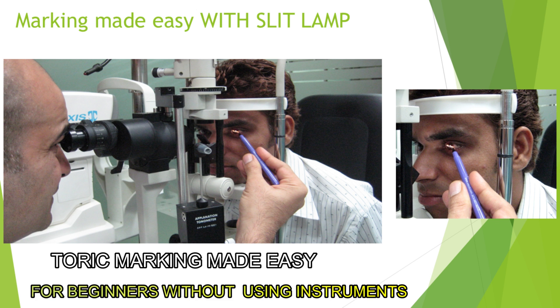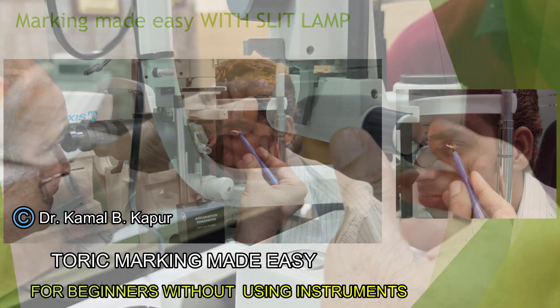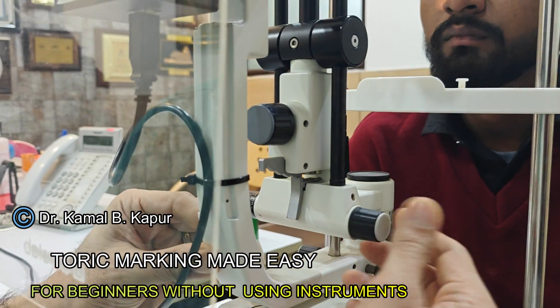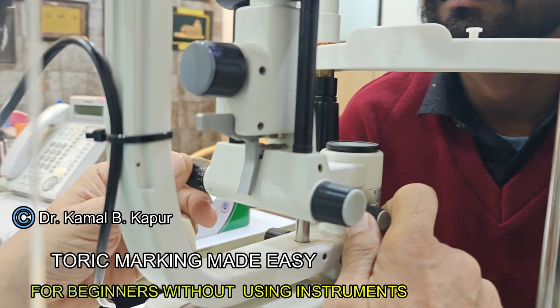Before we proceed to the live surgery, let me demonstrate an easy way of marking the primary axis of 0-180 on a slit lamp. First of all, you have to ensure that the patient's head is absolutely straight and stable, with the forehead touching the slit lamp support.